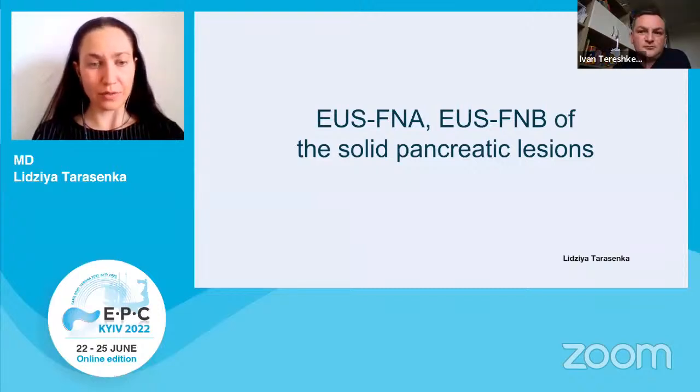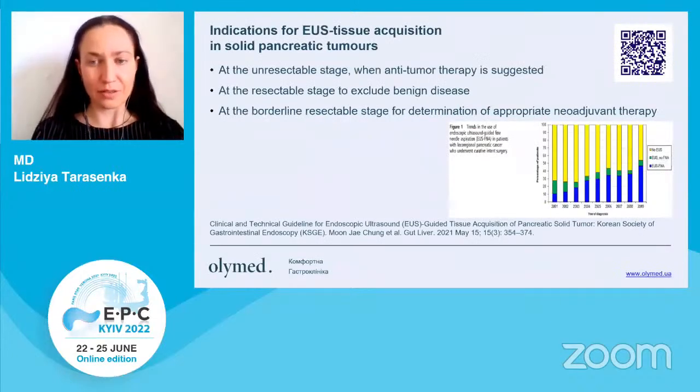At the rise of EUS, there were arguments as to whether we need biopsy of pancreatic lesions at all. This is a historical graph showing the increasing share of patients with pancreatic solid lesions who underwent biopsy. Starting from 2001 to 2009, this percentage was gradually increasing up to 50%.